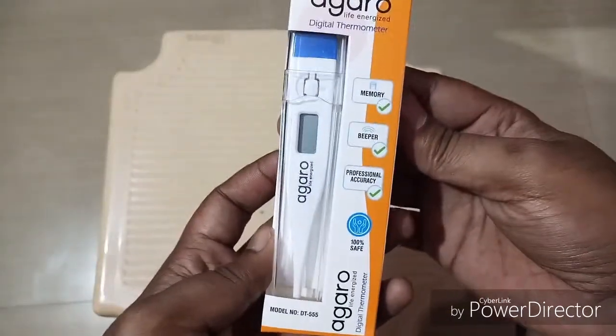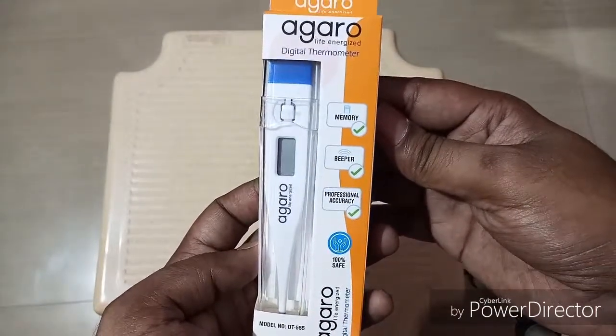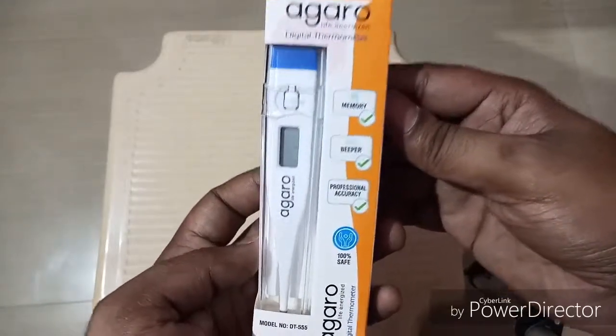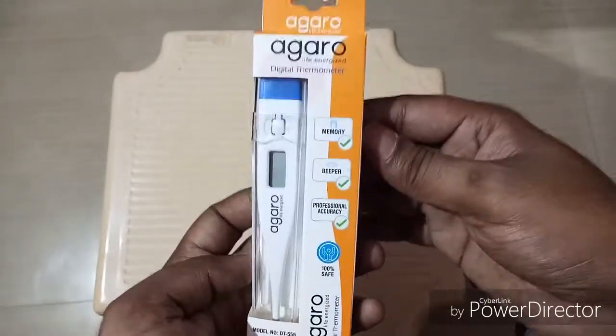It's not costly at all, so it's better to have one at home. Whenever there is a fever or you're feeling any temperature, this kind of small device will help a lot to know how much the temperature is and whether you need to consult a doctor.